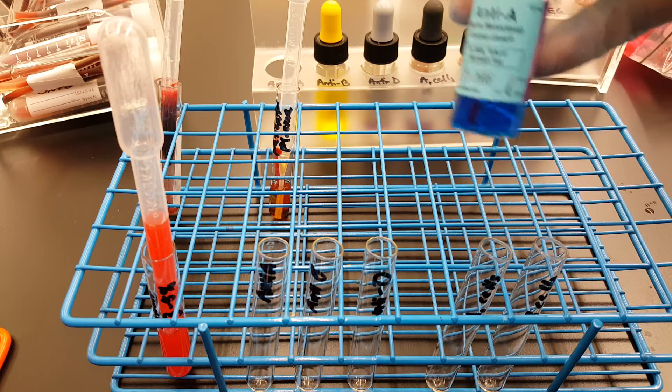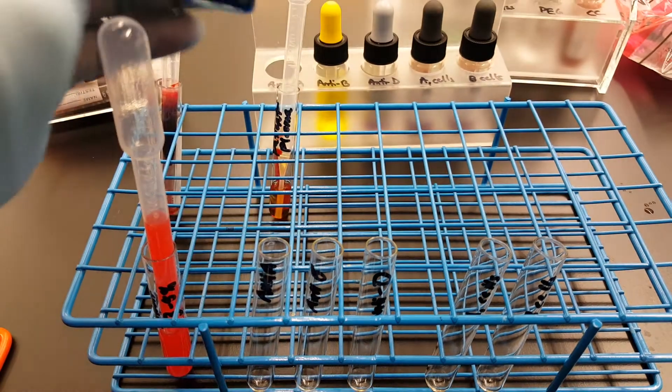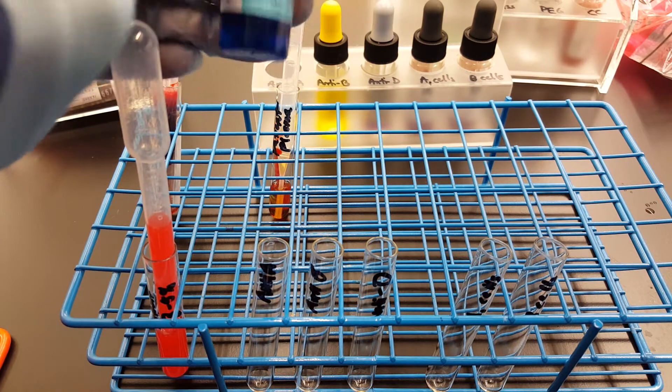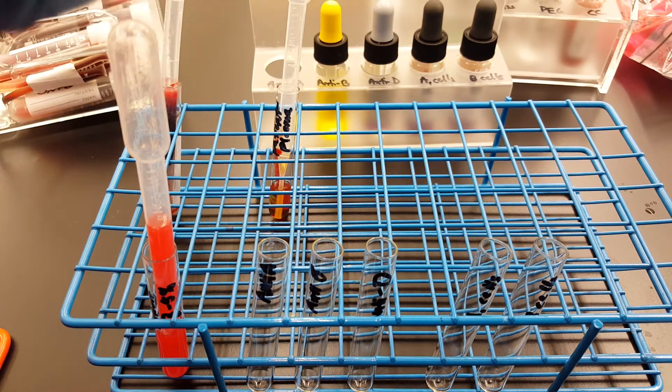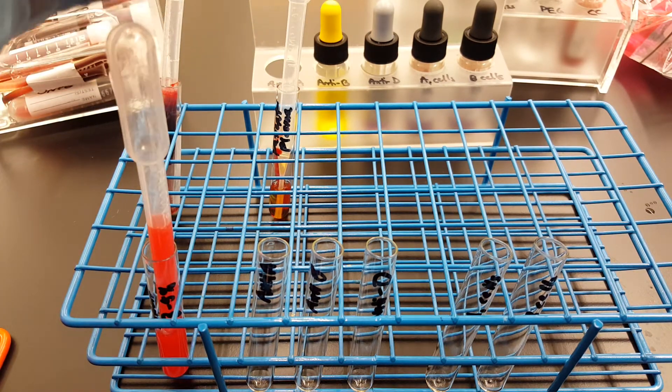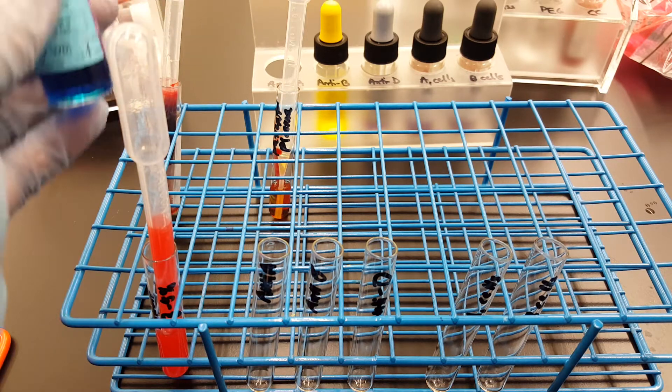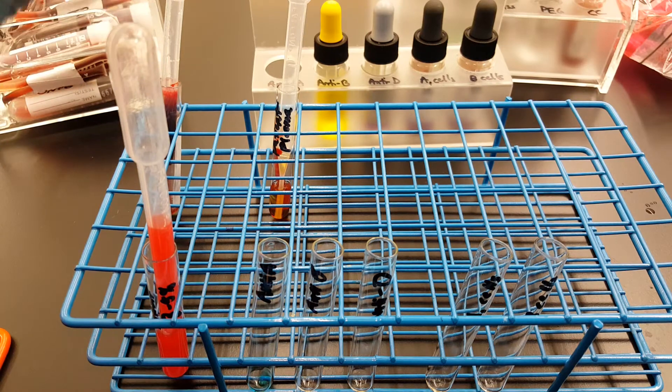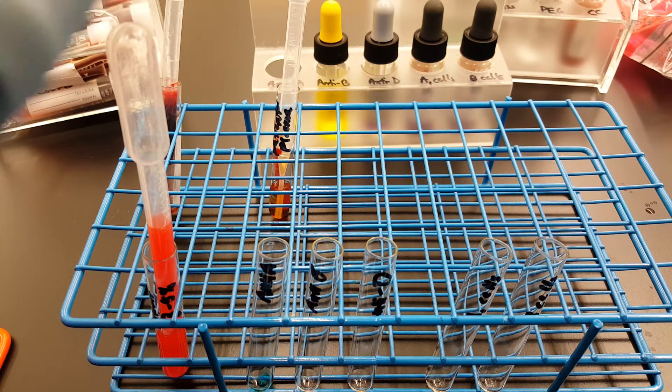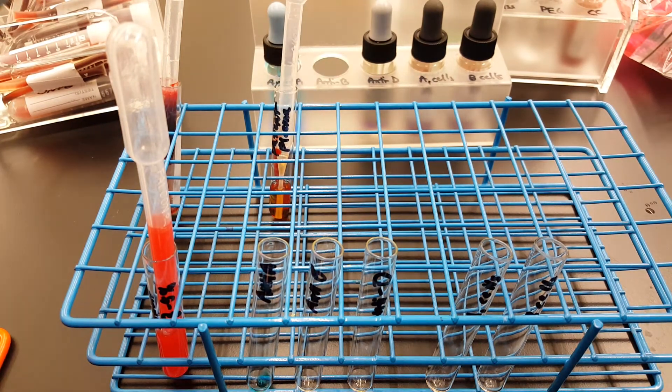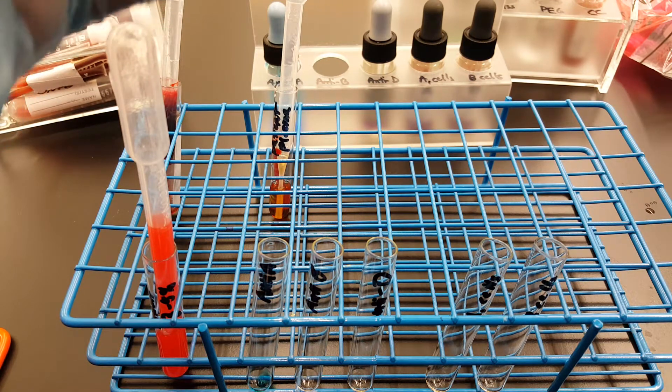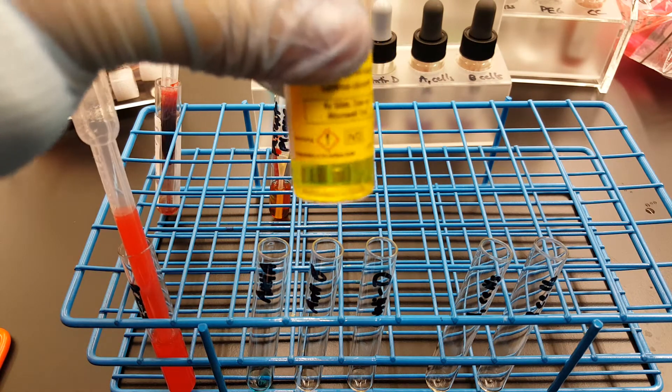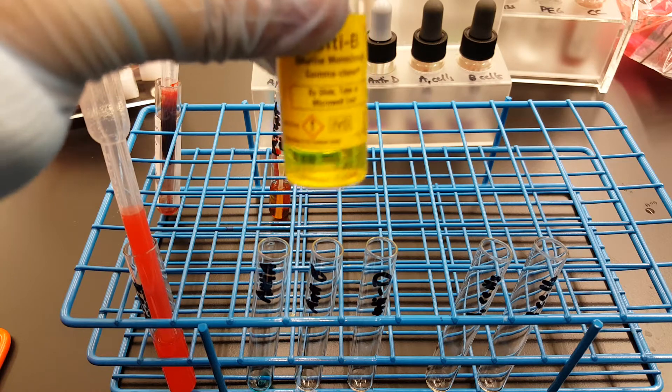So I'm inverting each reagent first so that you know that it's mixed, and I'm going to add a drop of each reagent into each tube. So that was anti-A, part of the forward typing. This is anti-B, which is yellow, and it's part of the forward typing as well.